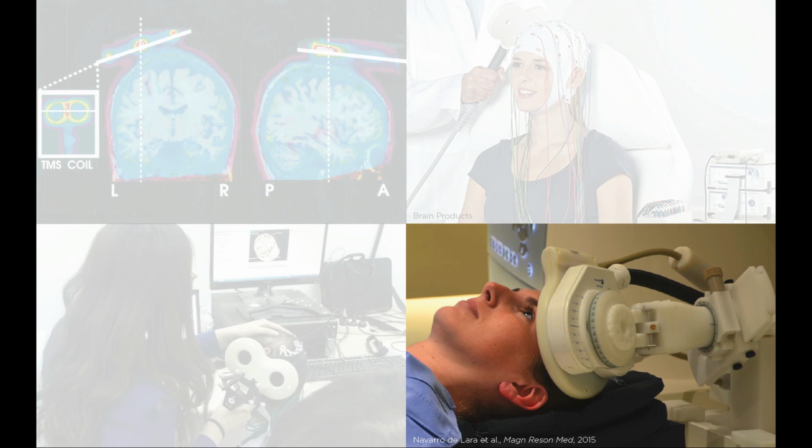It can generate a torque in the TMS coil, and so the TMS coil design needs to be very sturdy, and also you can only use planar figure-8 coils to cancel out the torque. If one were to use a circular coil, there is too much torque and the coil will try to rotate and perhaps rip apart in the scanner.